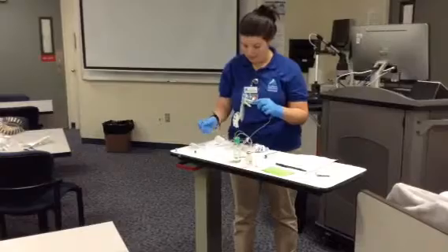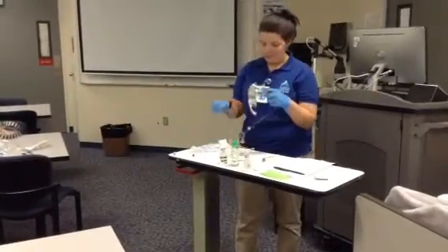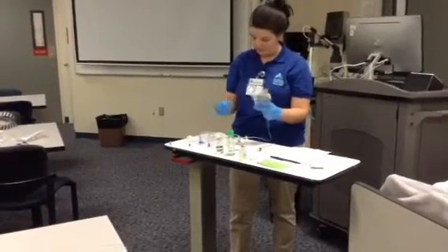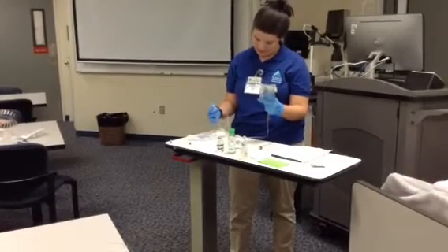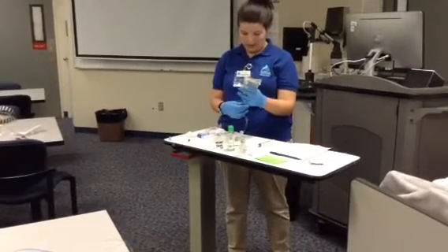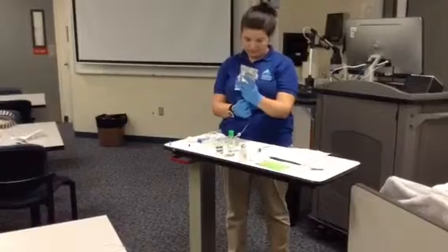Okay, prime that, make sure it's good. Alright, good. And then I want to check my drip factors.